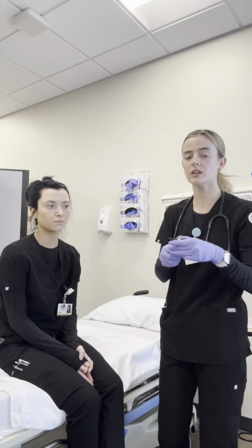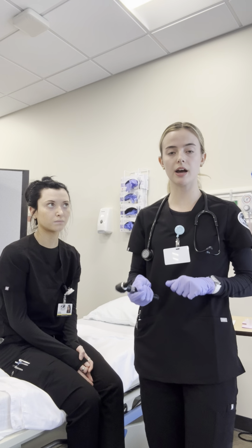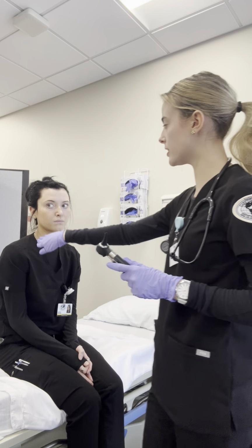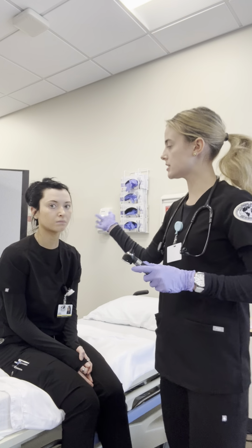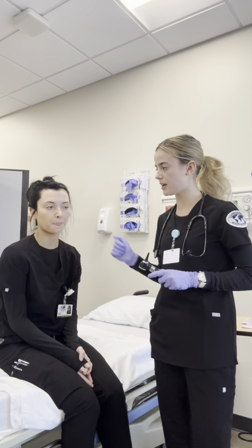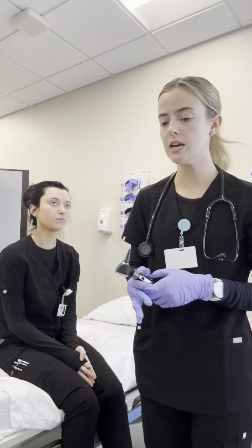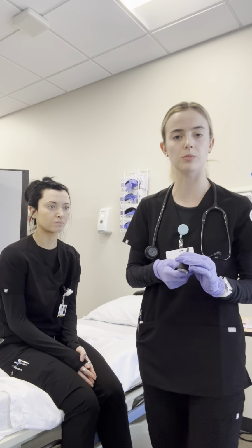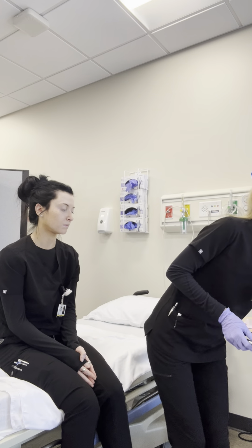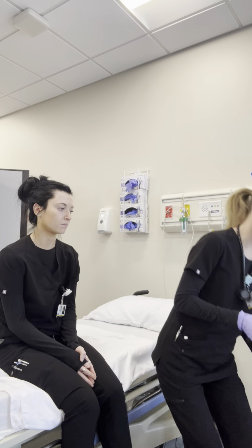Okay. After doing that, the tympanic membrane is pearly gray in color. There's a 7 o'clock or 5 o'clock light reflex on the right ear, 7 o'clock light reflex on the left ear. There's no bulgings or retractions, no perforations, and the umbo, handle of malleus, and short process are all visible in the ear. I'm just going to clean off my otoscope before I put it back.